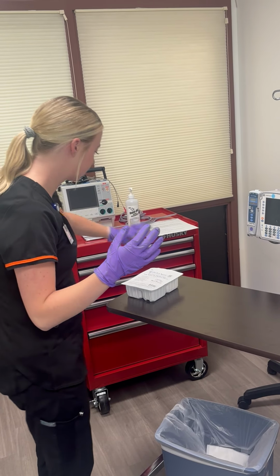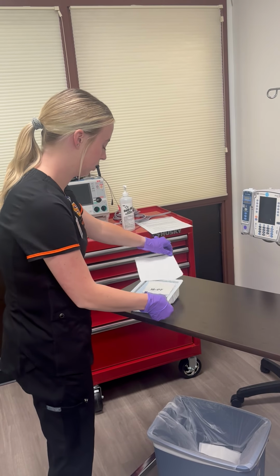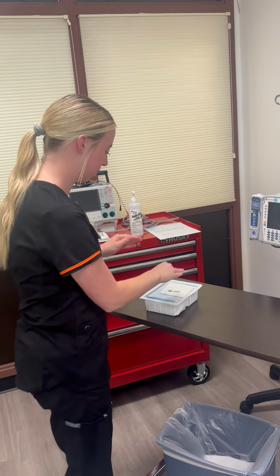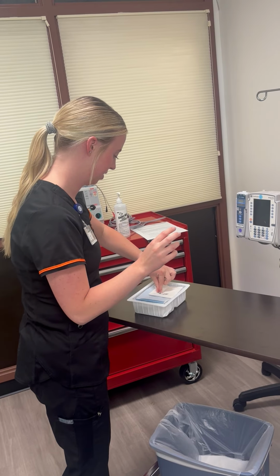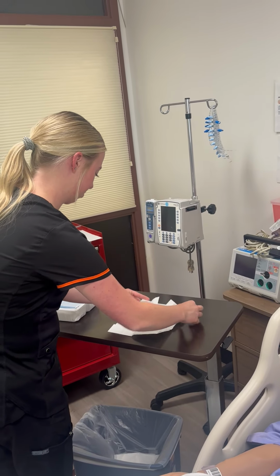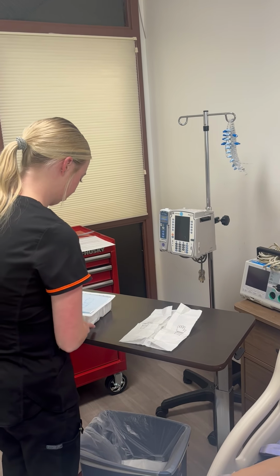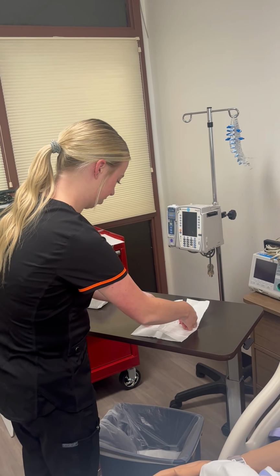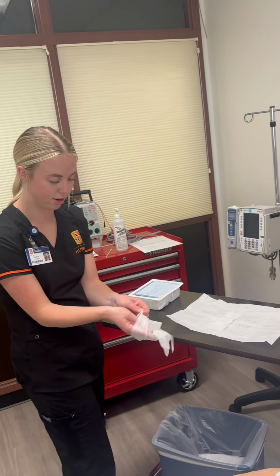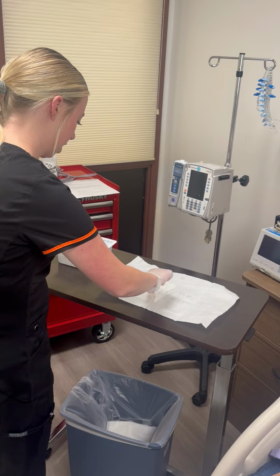Next, I'm gonna open this. So I'm actually gonna turn it around and peel this back. Okay, I totally messed that up. Taking these off, that's my bad. I'm gonna put the ones on in here because that's sterile. So pinch these, and let's open this and do this right this time. I don't know why I put this on before. All right, doing this correctly. Let's move this by the bottom out of the way. And let's do this accurately this time. All right, here we go. Put these on carefully without touching. Make sure to keep it up. I'm gonna come down here.